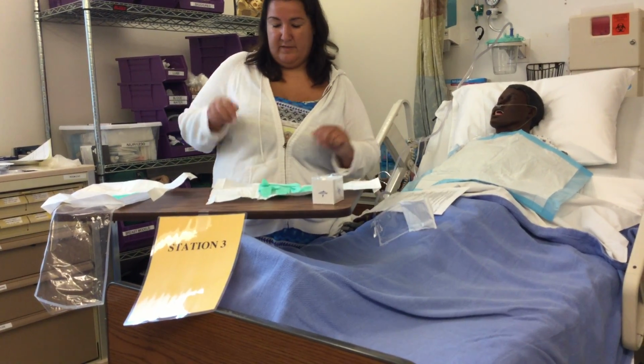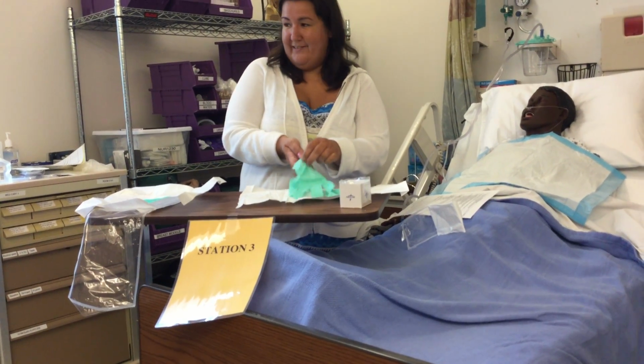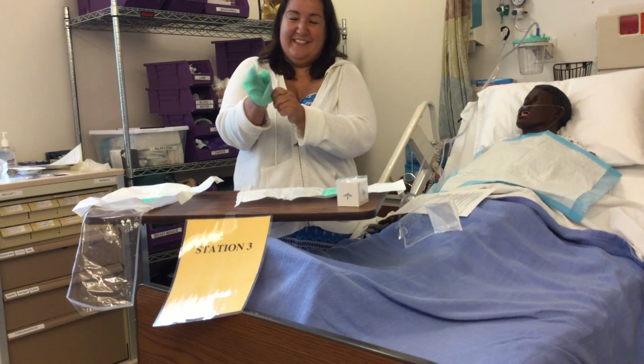Make sure not to go over the package at all. Grab my first glove, and Donna, let me know if I do anything. If I screw up in any way, or you guys, you could call me on it. Don't do this. I did? No.